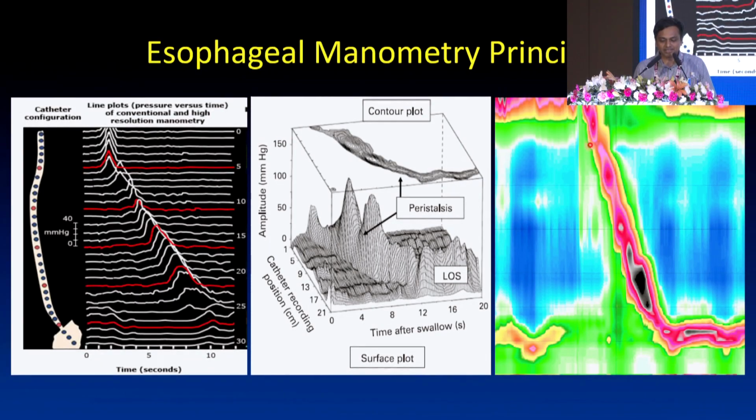So if you look at this graph and you compare with this, these are the 2 sphincters. This is the upper sphincter at the top. And again, you see a high pressure zone at the bottom. This is the lower sphincter. So all sphincters are contracted even at rest. So you'll always see a high pressure zone wherever there's a sphincter.